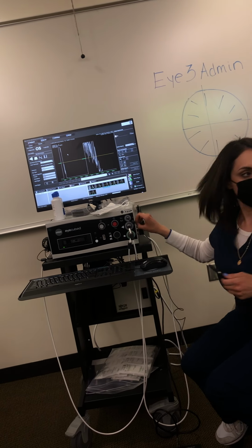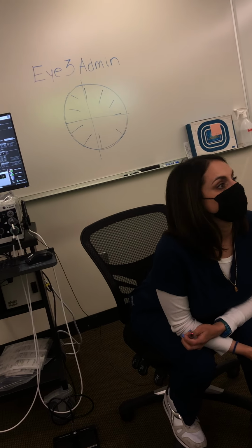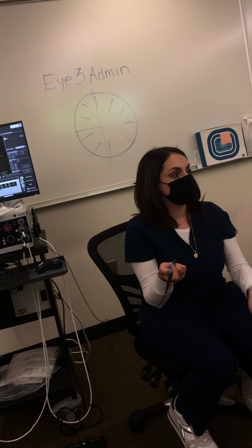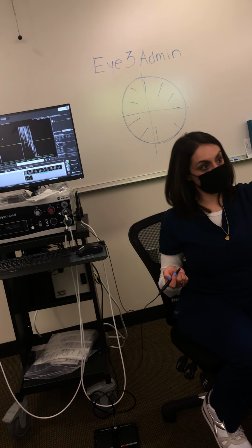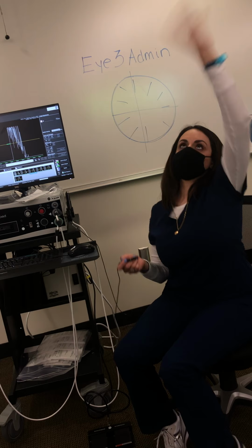Because when they tell me to look at the red line, I'm just like, what do I do with the other eye? I have a feeling I will look to that side too. So I always just say, okay, with your other eye, just find something on the ceiling to look at, if they have vision. Or you can have someone else hold their hand for them to look at, if they keep moving. Or, well, no, you can't because you're squeezing water, but put something on the ceiling.